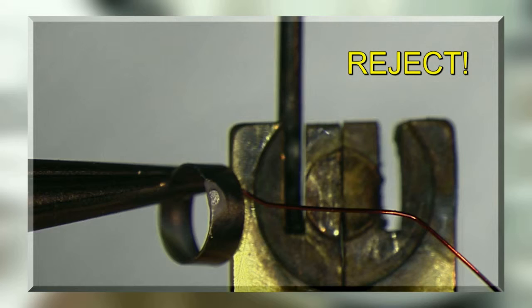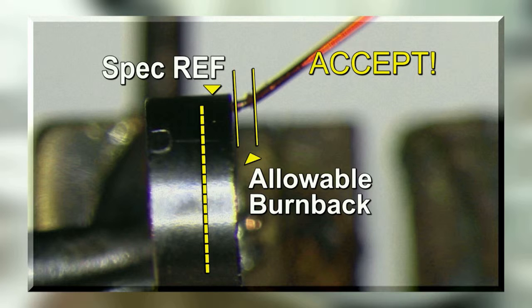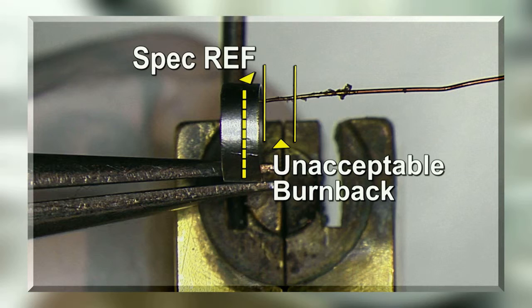Scrap the part if there is braze paste on the outside surface of the ring. Ensure the wire insulation was not melted away or burned back more than half the height of the ring. This shows an acceptable level of burn back.